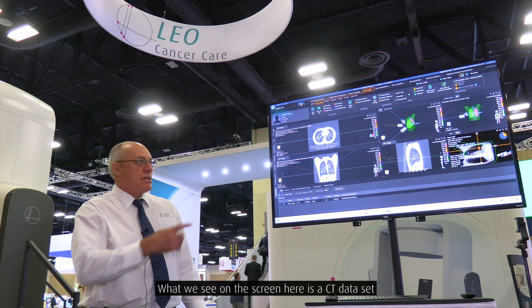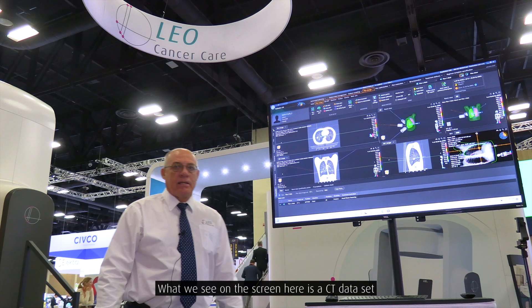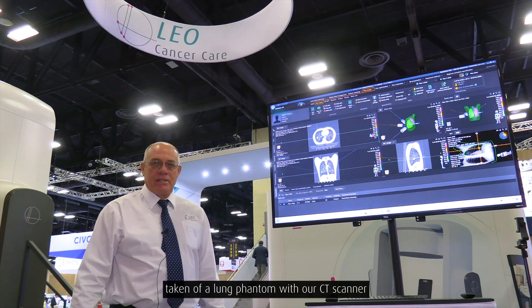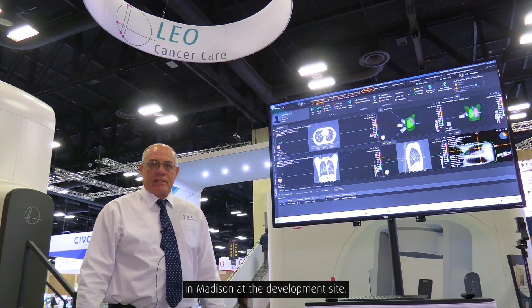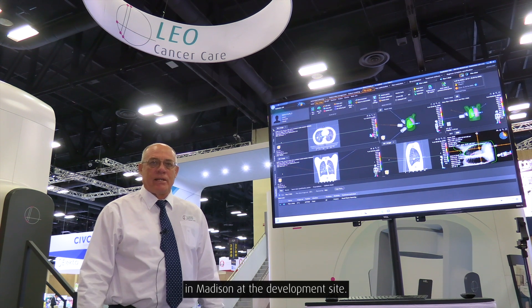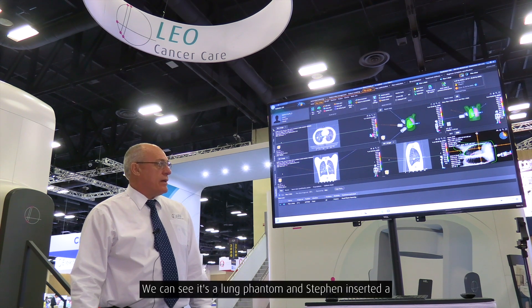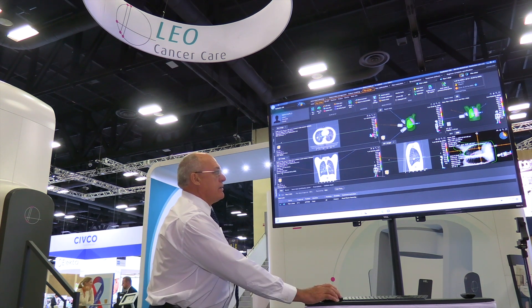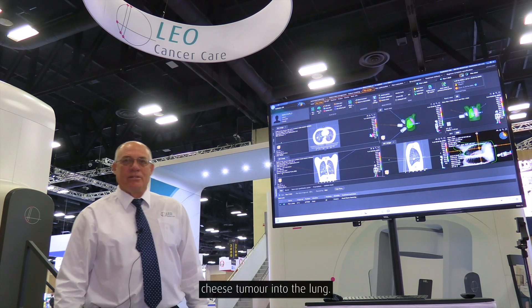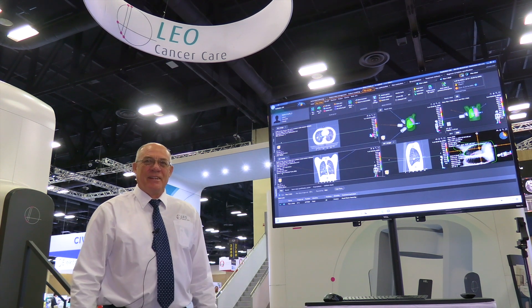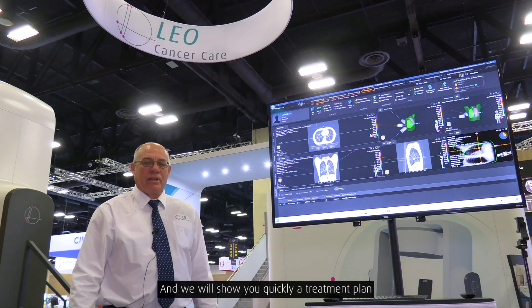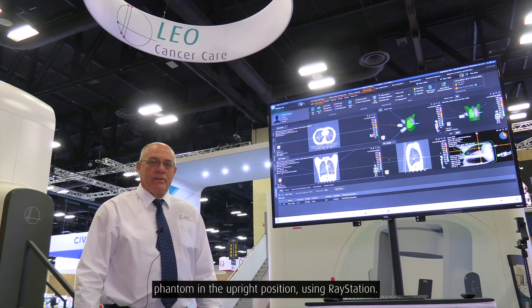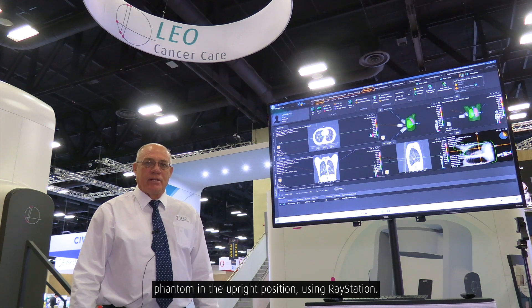What we see on the screen here is a CT data set taken of a lung phantom with our CT scanner in Madison at the development site. It's a lung phantom and Stephen inserted a cheese tumor into the lung, and we will show you a treatment plan developed on our lung phantom in the upright position using RayStation.